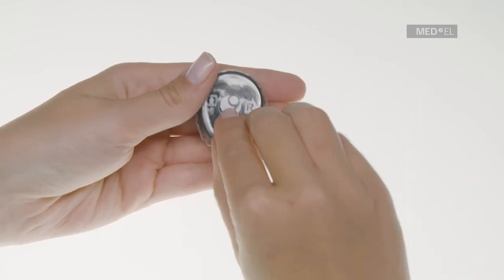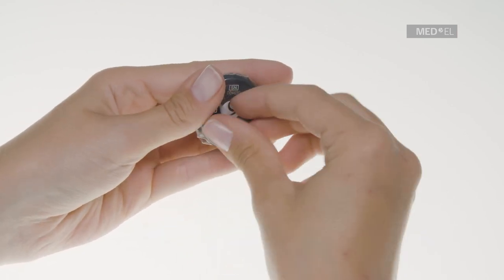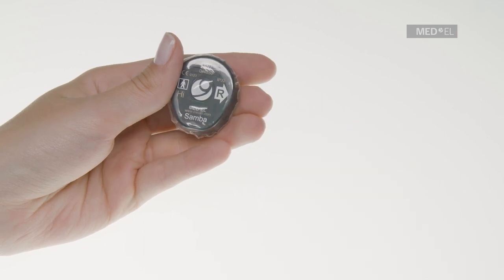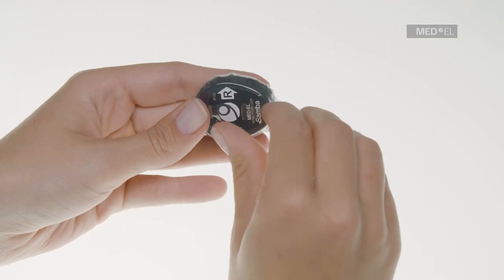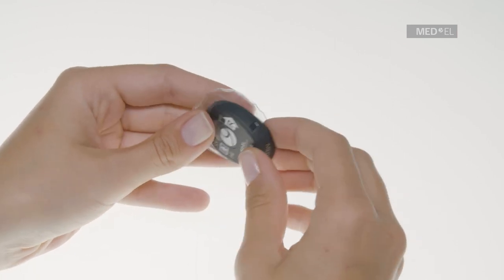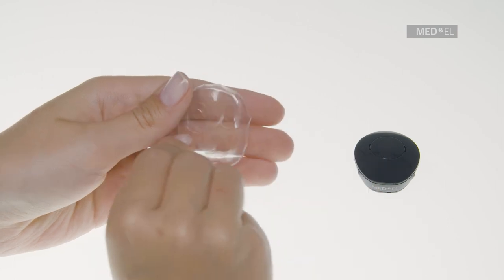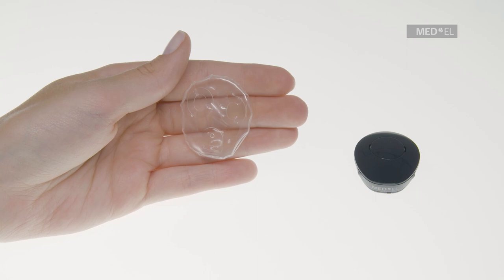To remove Waterwear from Samba, first remove the attachment clip and then carefully remove and discard the adhesive seal tape from Waterwear. Use the rectangular flap of the skin to gently pull Waterwear off of Samba. Make sure that you do not damage Waterwear. The skin of Waterwear can be used up to three times, but the adhesive seal tape needs to be replaced each time.